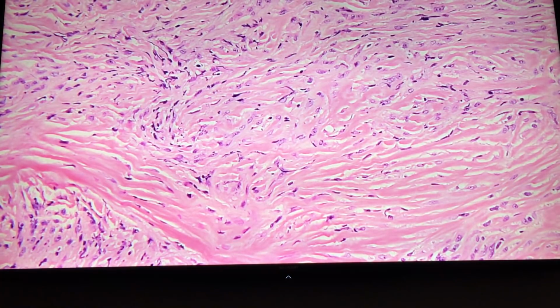You want a generally elderly person with a rind or multiple pleural nodules. And of course, no history of anything else. If you had all that perfect, then you can call it. Otherwise, you want to back away from calling, especially in a small biopsy. Now, when you resect, you see all the architecture and it becomes obvious, but on a biopsy it can be very difficult. Okay, Aaron, great.